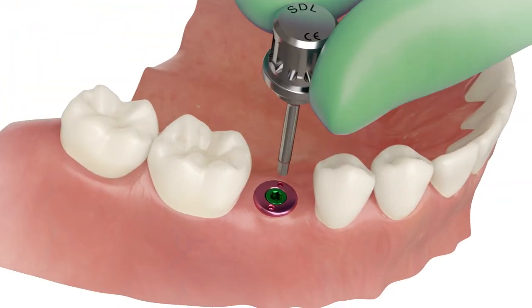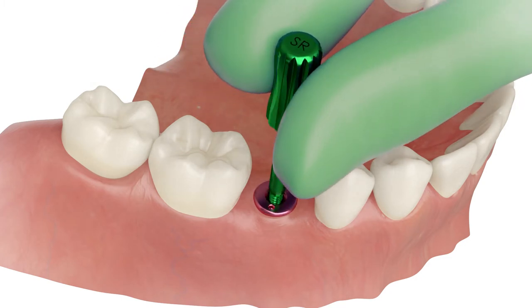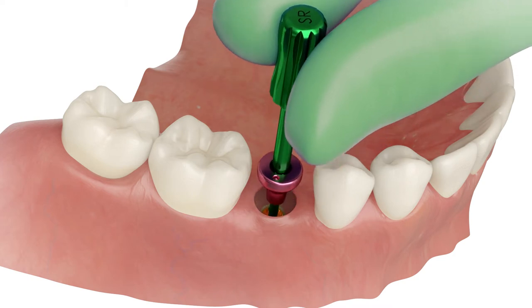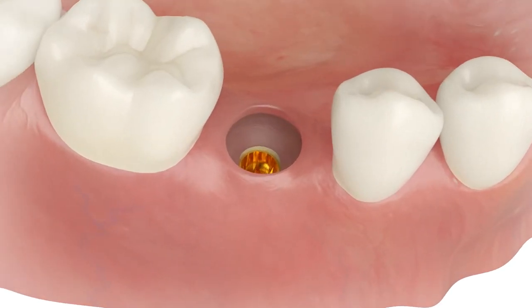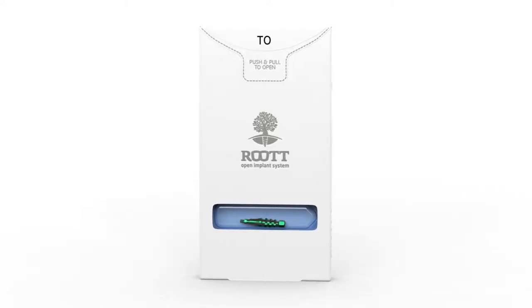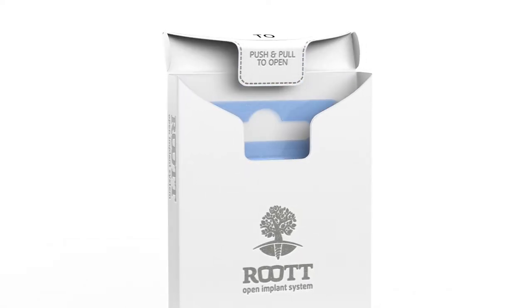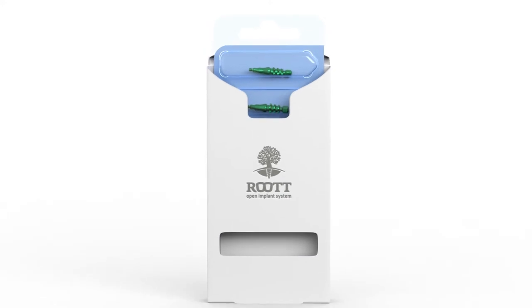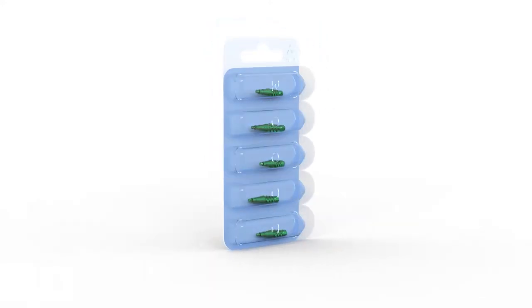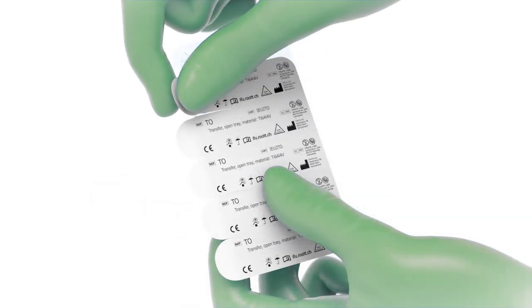Remove the healing abutment from the implant. Use an abutment extractor for easier removing. Open the box and open the blister. Sterilize products before use.